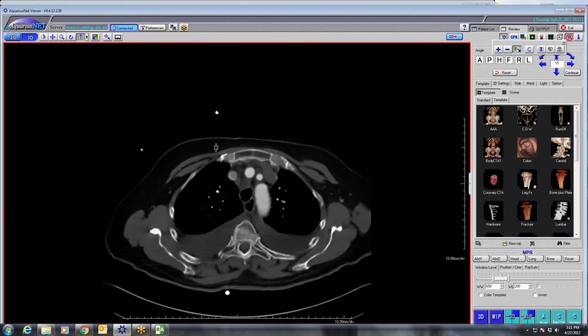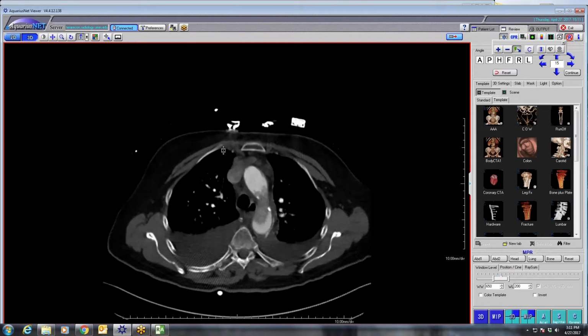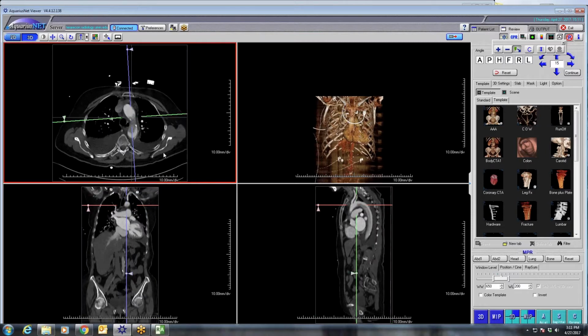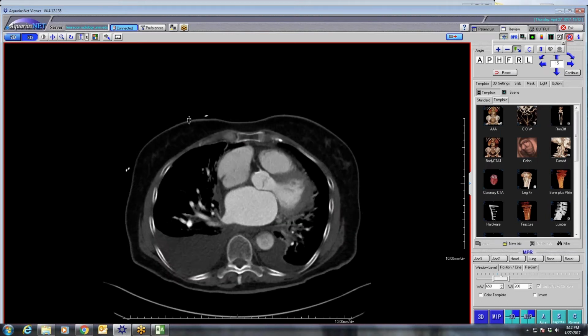I mean, I can look up. I actually think it was done on a flash or a high pitch helical acquisition, because I was actually impressed. I think the hospital that had it, I was surprised that they had the scanner. But there have been a couple of interesting outside cases. But I'll check. It's definitely on the DICOM data, and I know on the non-anonymized data I have that information because it tells which scanner it is. So I'll let you know. But it probably is one of the high pitch helicals, given how well these coronaries.